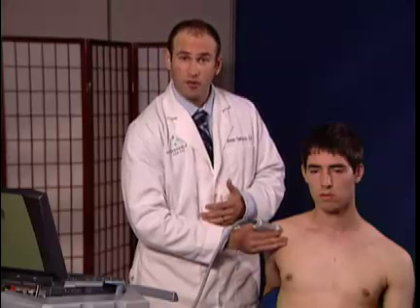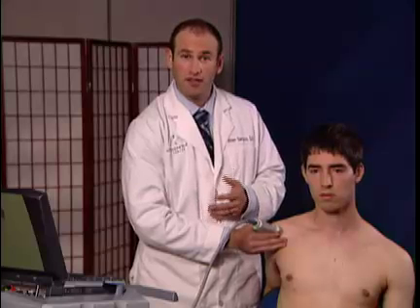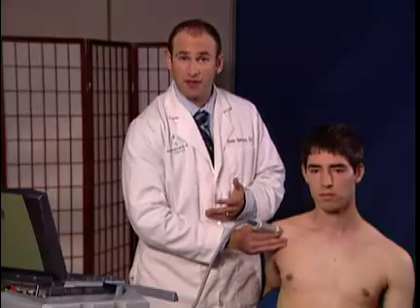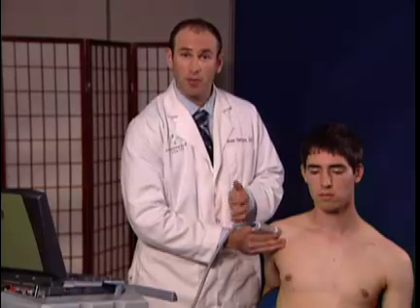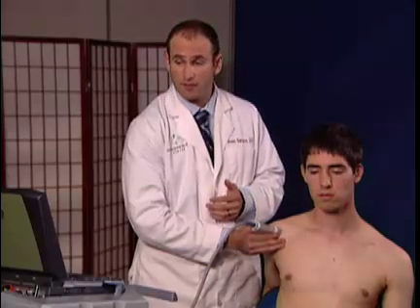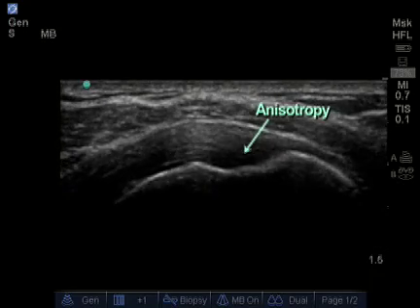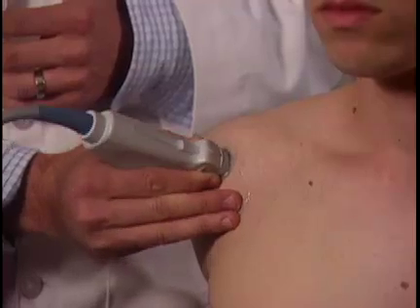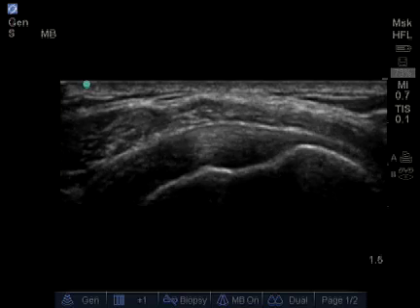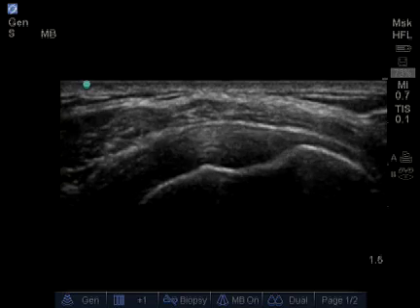One pearl to be aware of is a concept called anisotropy. What may appear to be an abnormality or a partial tear — where you can see a hypoechoic or black signal within a tendon suggesting a tear — may really just be a result of your probe not being perpendicular to the structure you're viewing. An example of that would be blackness in the tendon visible on the bottom aspect as it inserts on the bone. But by rocking the probe side to side, the blackness is removed, confirming it was anisotropy.